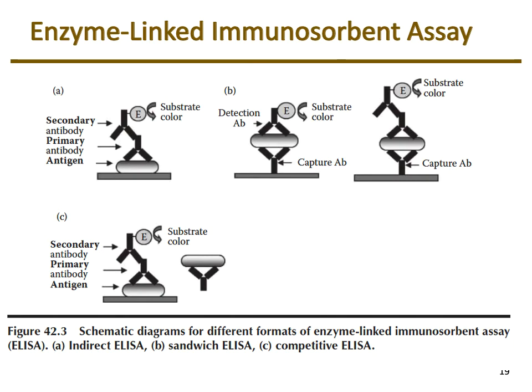With indirect, the plate gets coated with the antigen, and so you have to have special plates for that. So again, there's a whole bunch of different factors, and again, usually in the food industry, they're using commercially available ELISAs that have been standardized, that are approved by the USDA or the FDA in order to be utilized for that.